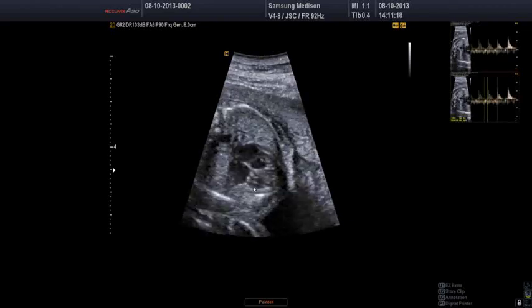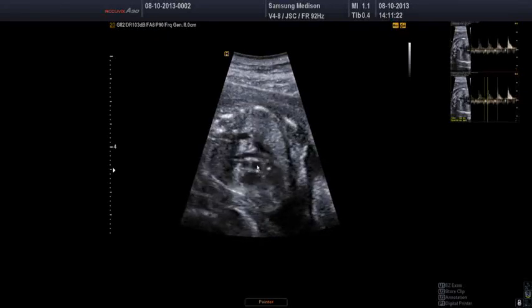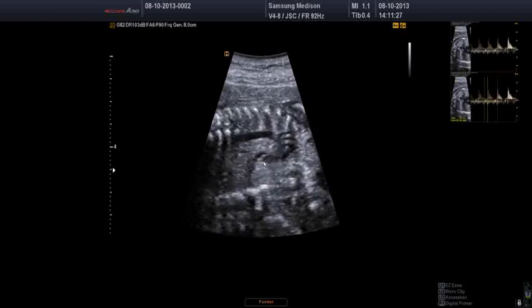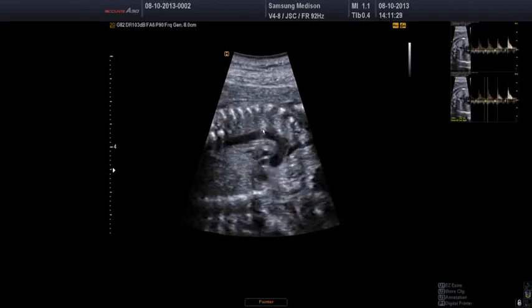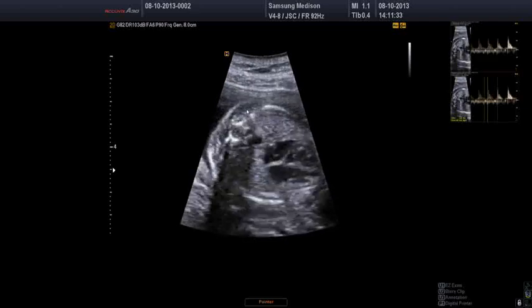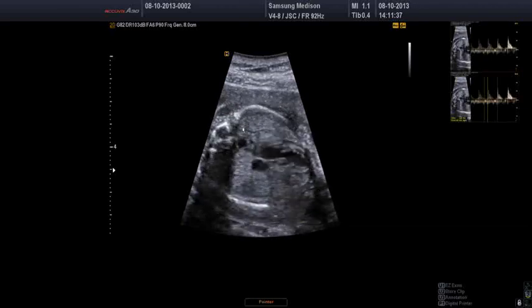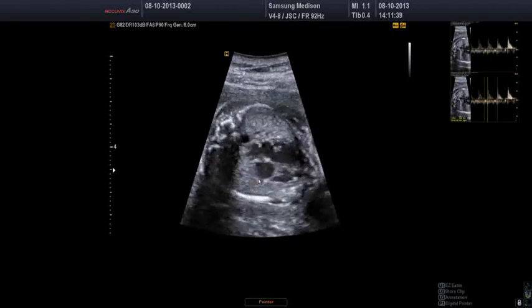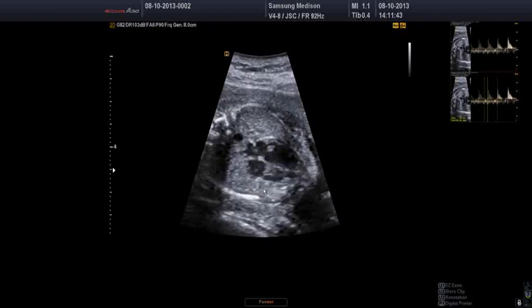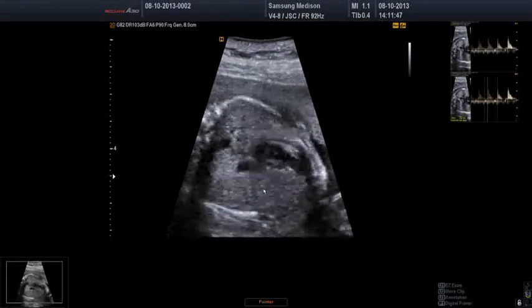And if you have the fetus in this position, it's almost dying to say you turn round and you can get the aortic arch here. And it's very easy to do that from that view. So you can very easily get your aortic arch from a position where the spine is on the top, so you don't always have to come from the front. And in this angle, either from this side or the other side, you usually can. Actually, in a way, the quality of the image coming from the back here is a bit better than it was because we're closer to the fetus.